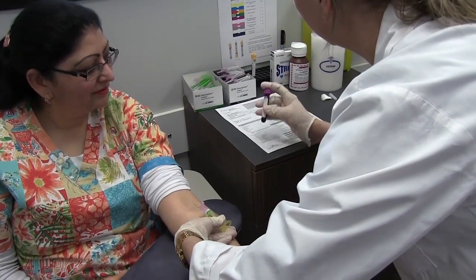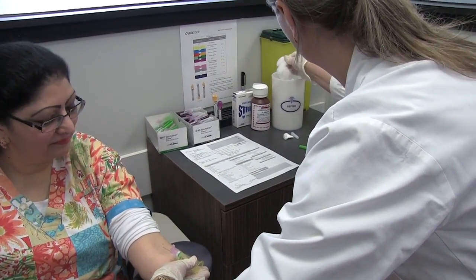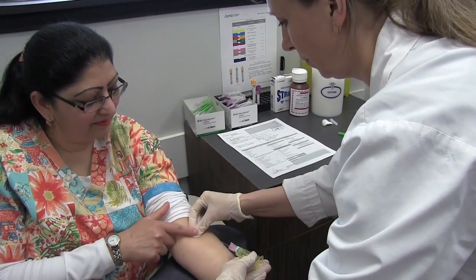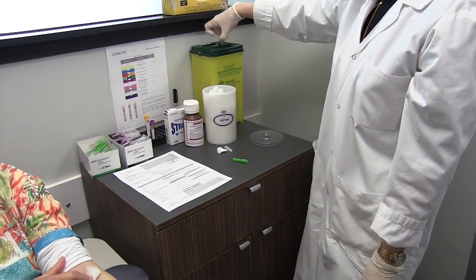Once the collection is complete, gently remove the needle and place a cotton ball over the puncture site. Ask the patient to apply pressure to the site. Activate the safety device on the needle and dispose of it in the sharps container.